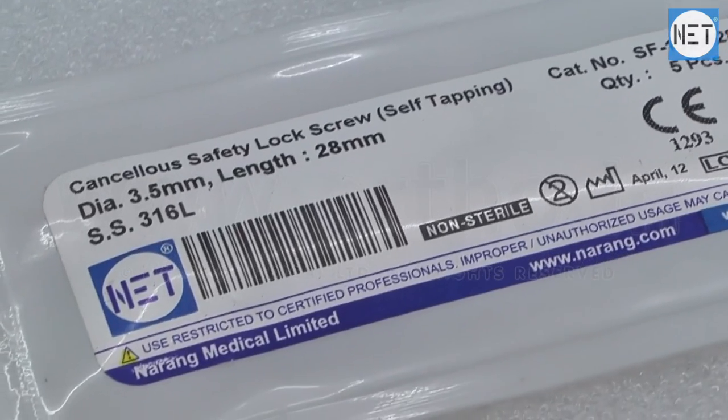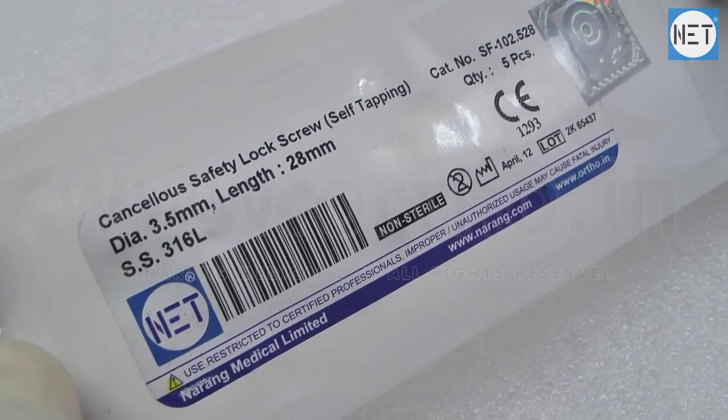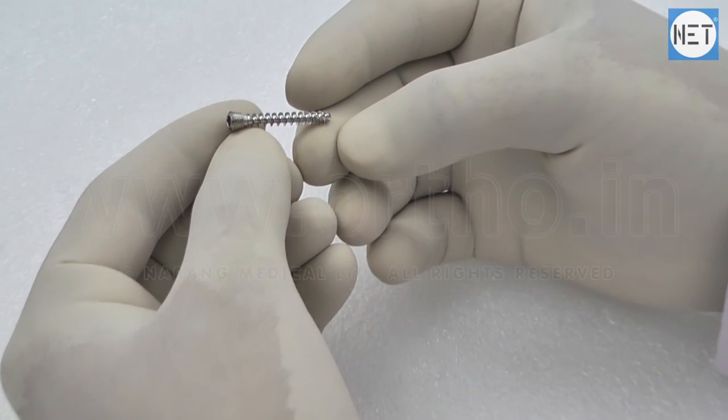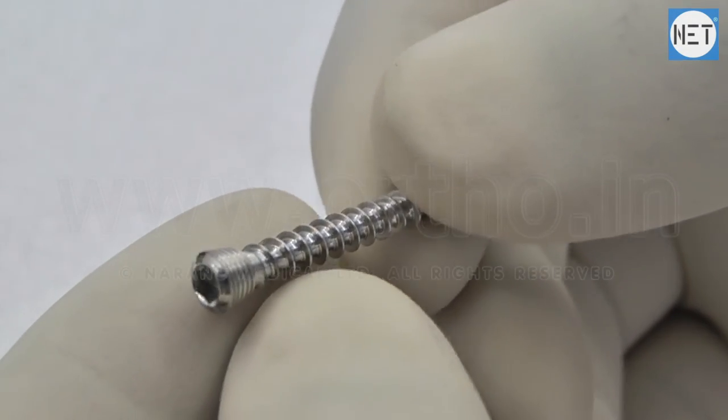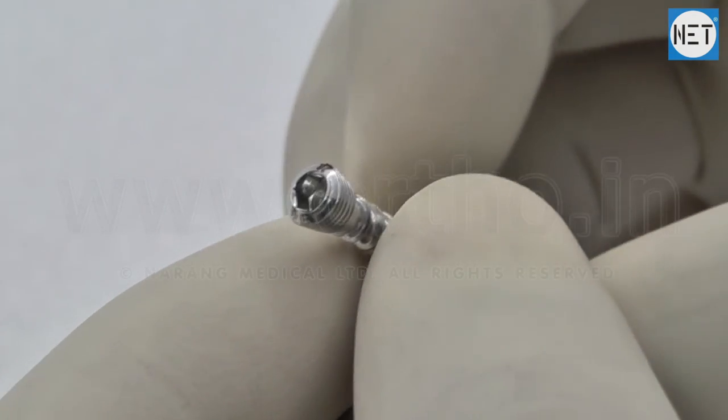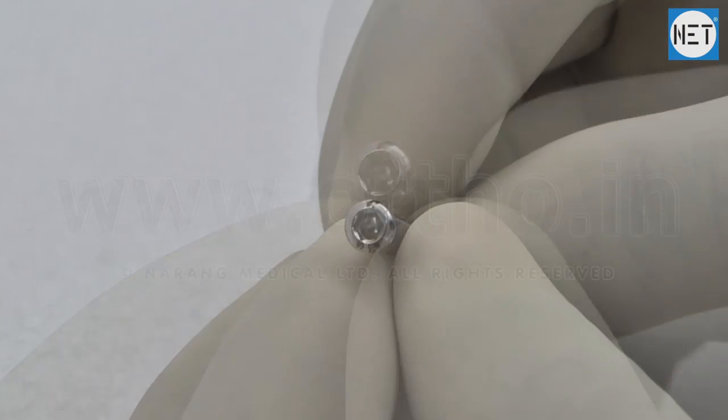Net Brand 3.5mm Cancellus Safety Lock Screw, Self-Tapping. These screws are designed for fixation in cancellous bones. The threaded head provides firm locking, and the self-tapping feature eliminates the use of a bone tap.